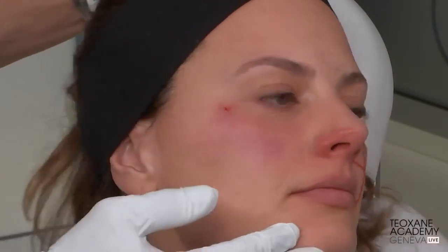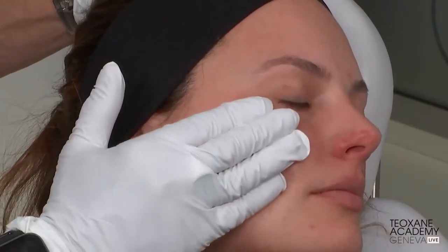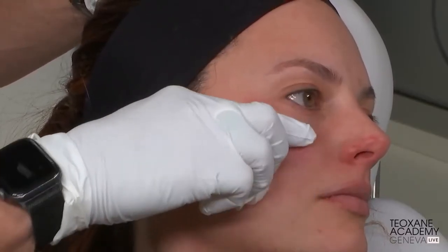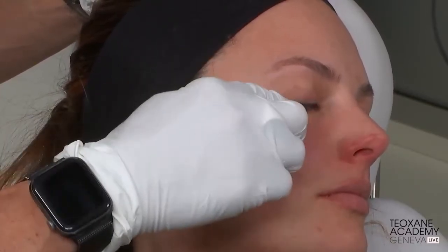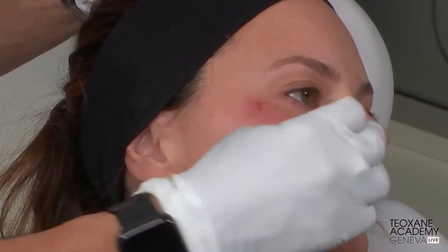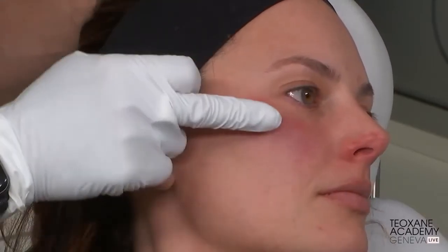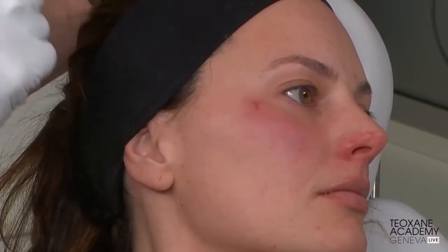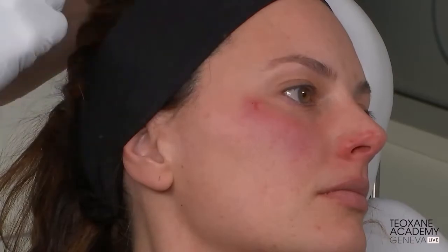So if you look at the patient already, in a side view, you should see, at least I do from here, but I hope to be able to share this view with you, that the impact here is to shorten the eyelid-cheek distance. So this is getting closer and closer, and I'm not done yet. And as you see, I focus my treatment. You can rest your hand.